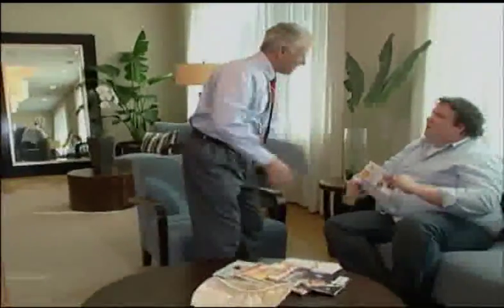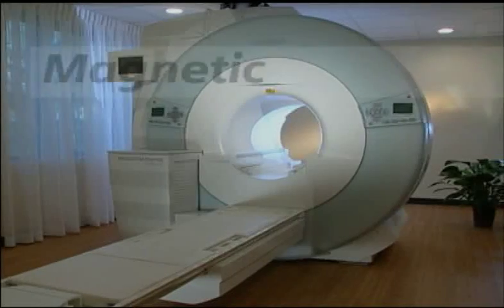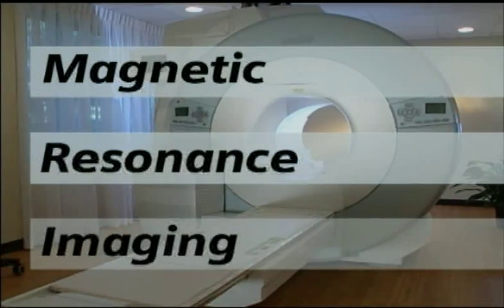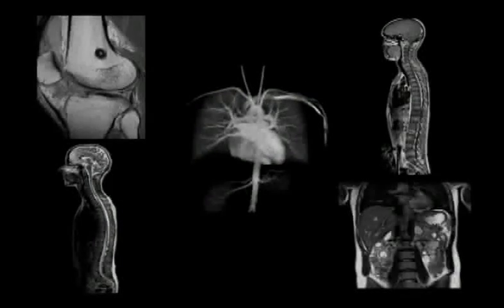Your physician has ordered an MRI examination. What is MRI? MRI stands for magnetic resonance imaging, and for the next few minutes, we'll discuss the MRI examination. You'll see some of the remarkable images produced by this type of medical imaging exam.